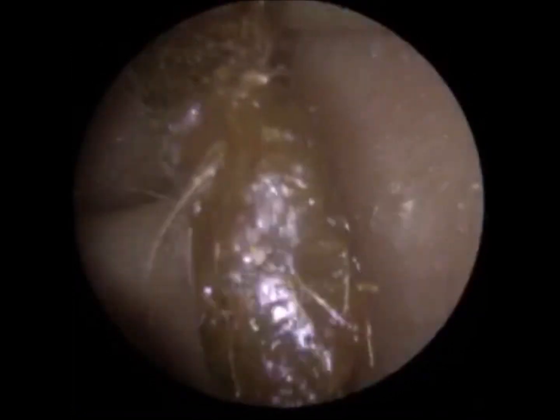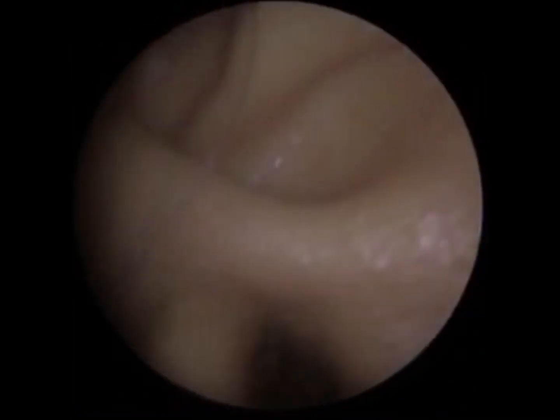There's quite a lot of dead skin. You can see the debris out here.